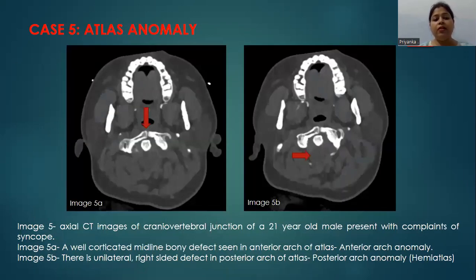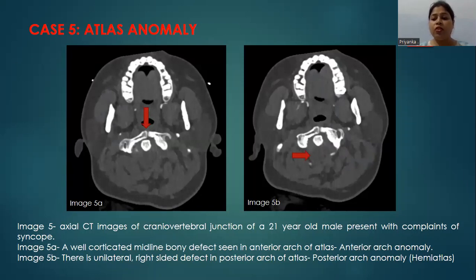This case demonstrates atlas anomaly. These are axial CT images of the craniovertebral junction of a 21-year-old male who presented with complaint of syncope. In image 5A, a well-corticated midline bony defect is seen in the anterior arch of the atlas, suggestive of an anterior arch anomaly. In image 5B, there is a unilateral right-sided defect in the posterior arch of the atlas, suggestive of posterior arch anomaly, i.e., hemiatlas.